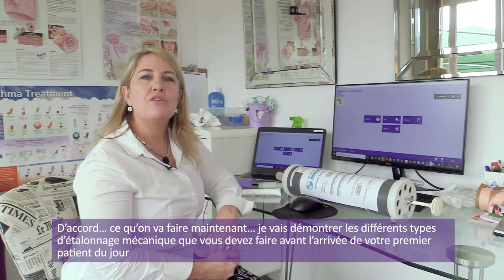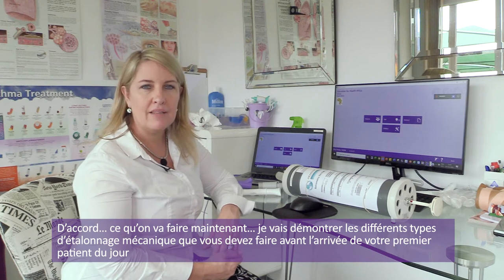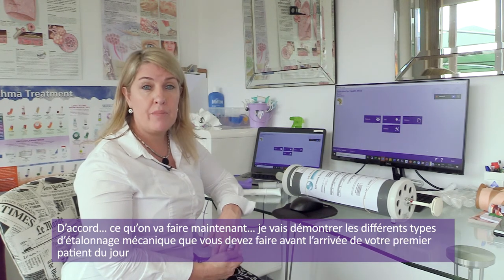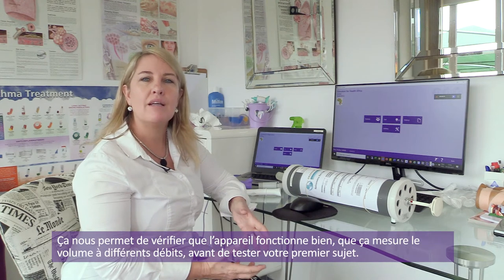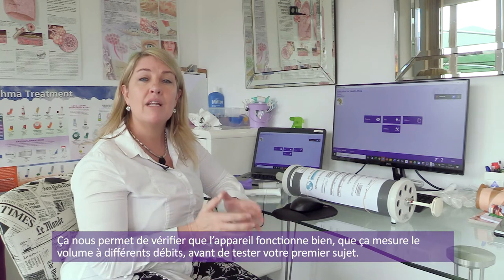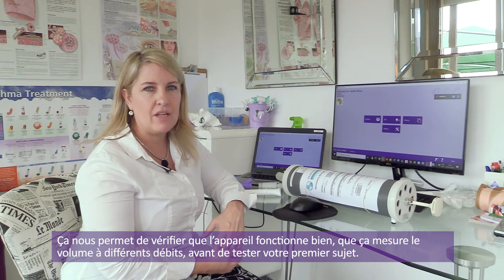What we're going to do now is demonstrate the various types of mechanical calibration that you need to conduct before your first patient of the day. What we're doing right now is checking that the machine is in good working order, that it's reading volume at the various flow rates before you test your first patient of the day.